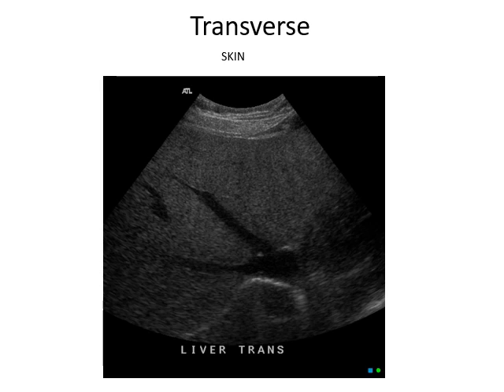Okay, on here again is showing you transverse. It's going to be some variation of transverse. You'll either see longitudinal or transverse on the slides. And here's the patient's left side, and here's the patient's right side. So again, you just have to make sure of your orientation. Just imagine the person's laying there, and the transducer is going sideways over them in this particular case.